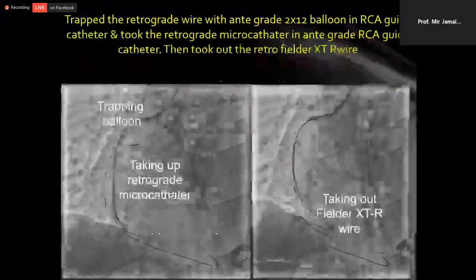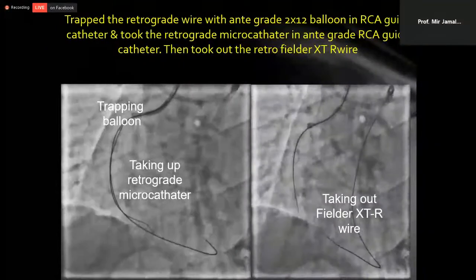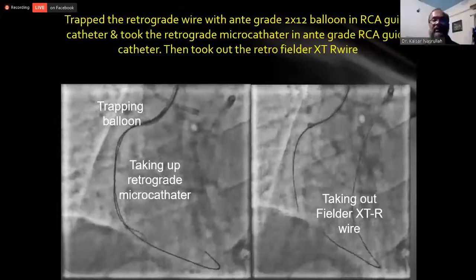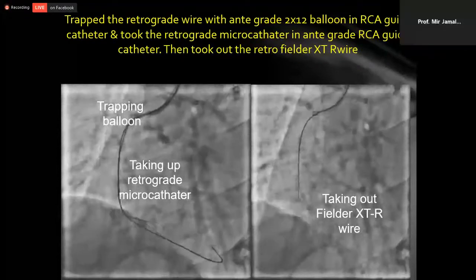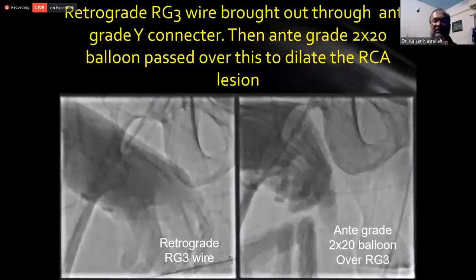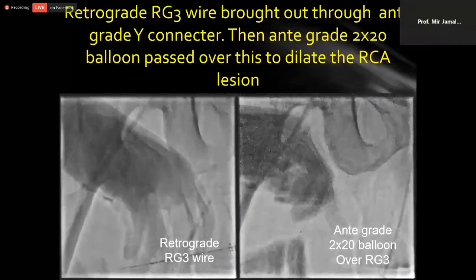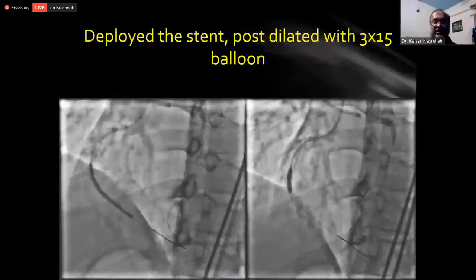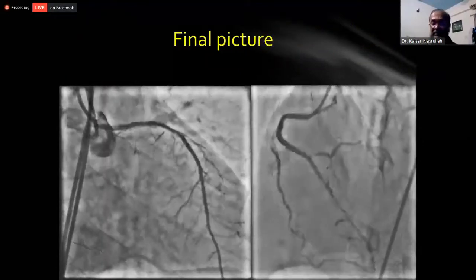After about 15 minutes, I took the retrograde wire up and the antegrade wire, and then dilated the lesions and deployed the stents. And this is the final result.